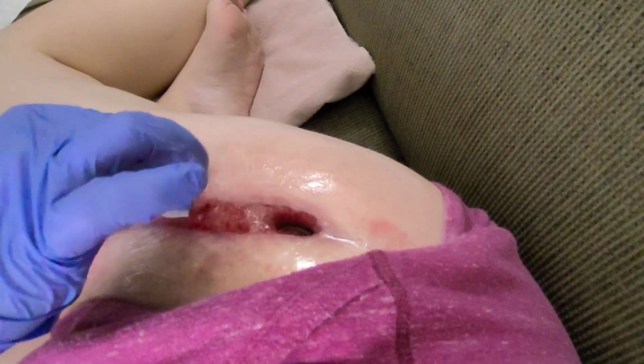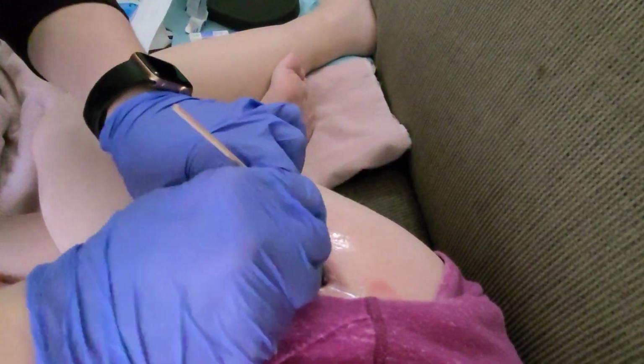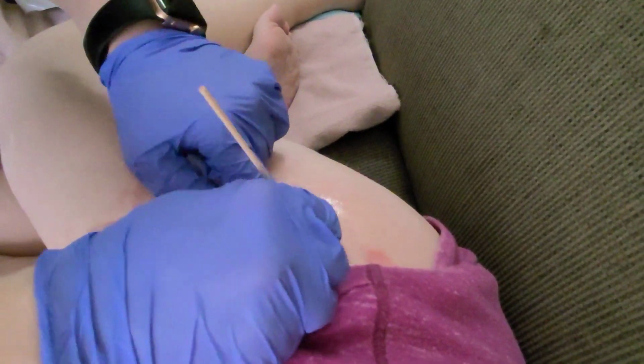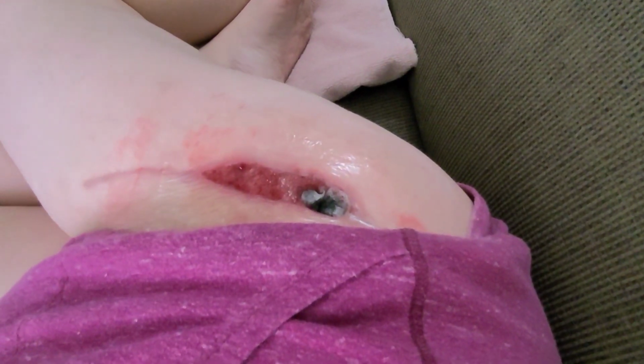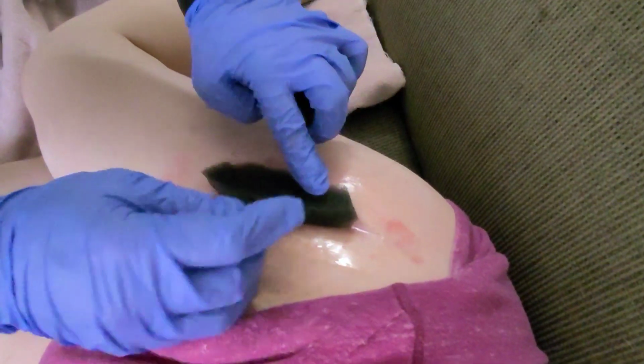She then once again cleans the wound really well so that we can start applying everything we need to and making sure there are no germs. She is now putting the piece of foam inside the wound with a piece of plastic wrapped around it to keep the opening of the wound so that we have a nice hole where the fluid can come out. Because if the wound completely closes, then the fluid will be trapped under there and can get infected.